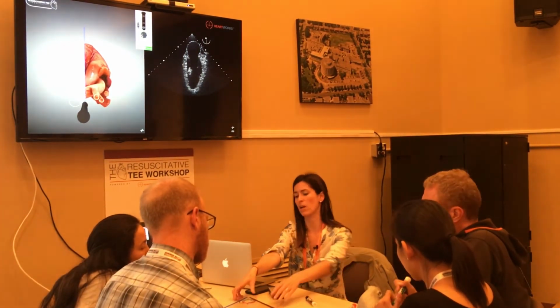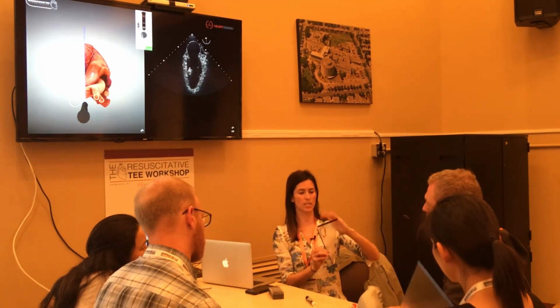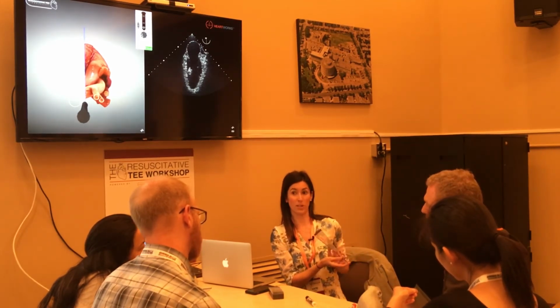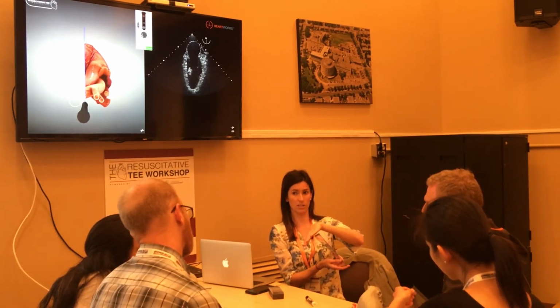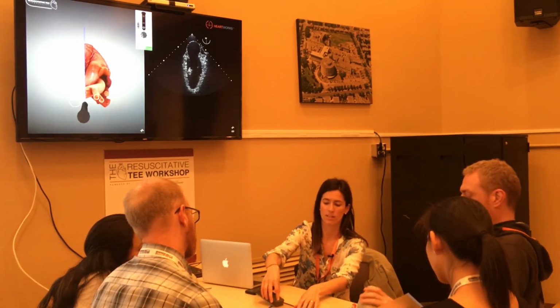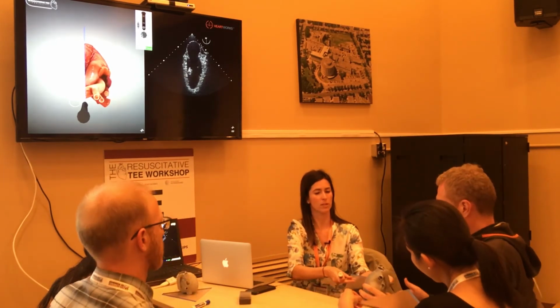And this makes sense, right? When I'm using my plane, I'm coming down, of course, anterior, inferior, and now just a little bit, 120, 130, inferior lateral, anterior septal. Great. All right, we have another one. That is the bicaval view. Take me through.